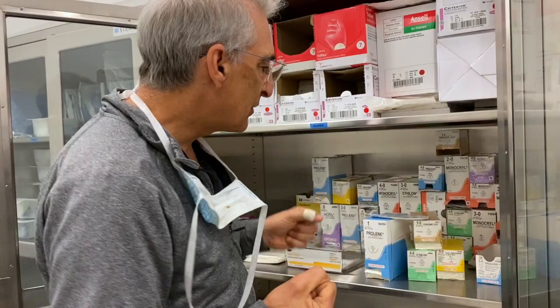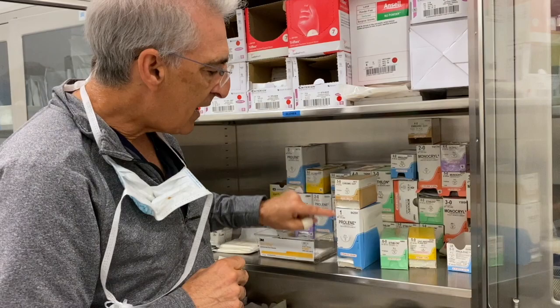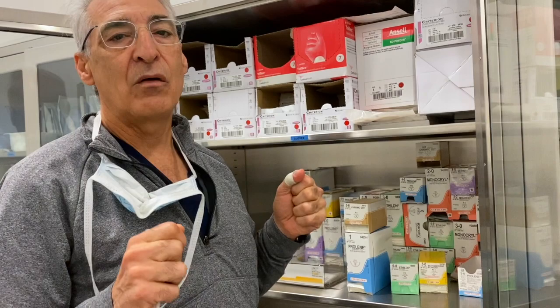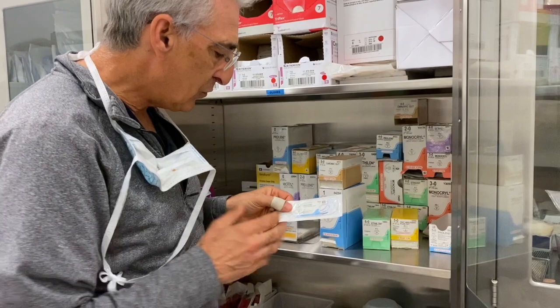Tensile strength is how much you can pull on a suture before it breaks. Whether you're looking at chromic gut, nylon, or Prolene, if it's the same size number, it will have the same tensile strength. So the surgeon knows that if they want a certain strength, no matter what the suture material is, it will be the same strength as long as it has the same number.